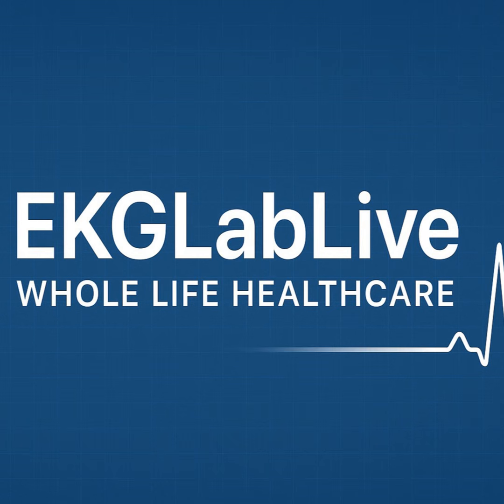So let me push back on that a bit, though. It's so tempting to just see a fast, narrow rhythm, slap the SVT label on it, and move on to the next monitor. But you're saying that shortcut is a major pitfall. If I'm the monitor tech, my job is to alert the team that the patient is in a rapid, dangerous rhythm. The doctor's going to order the meds anyway. Does it really matter if I specifically identify a pseudo R prime wave?